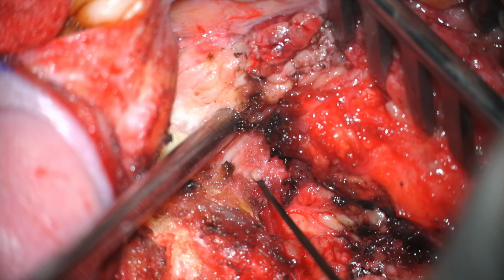Okay? I'm feeling through, and I'm checking around. Now, it's not high enough to get feels from there. See that? Look. Did you see that? Right. So it's deep down there. It's about that deep in there. You see? That's about that depth right there, and it's still not exactly this. So we know that this is very safe.